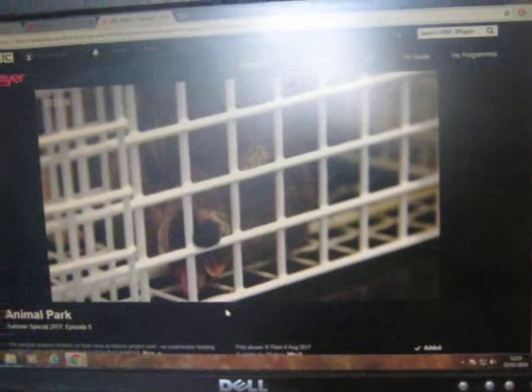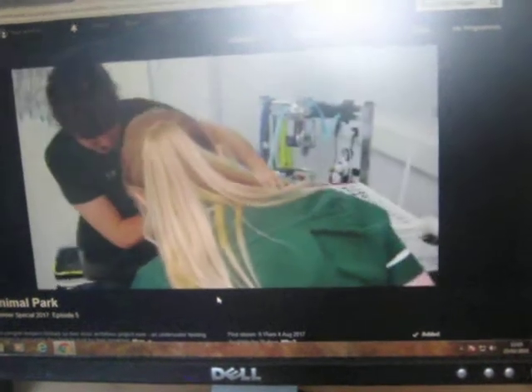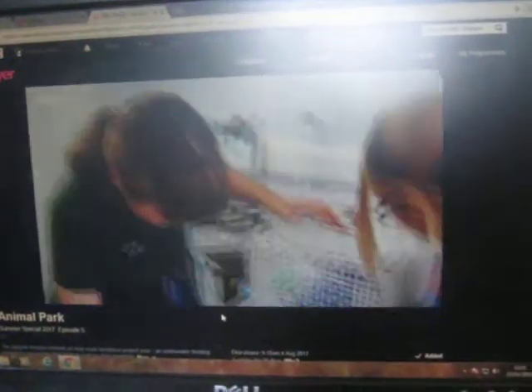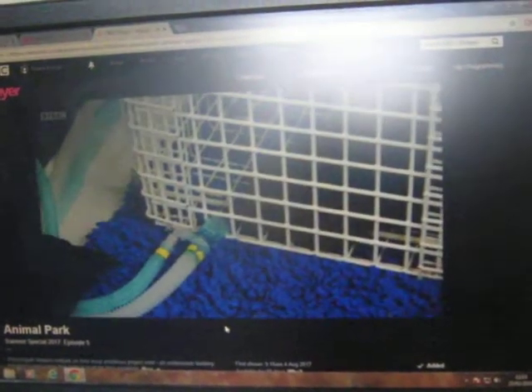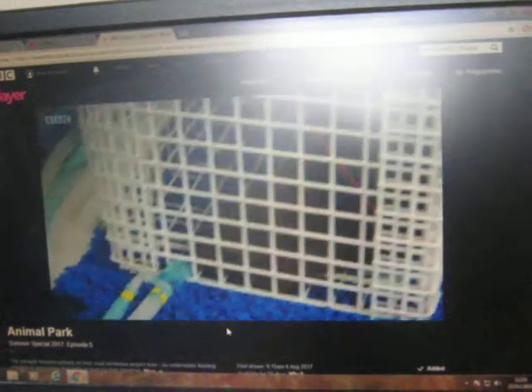Five minutes later, and the dose seems to have been sufficient to put him under. He's looking like the sedation's had a pretty good effect. We just need to get him on to some oxygen now, and then we'll start with a cautious little poke test, which he's not reacting to.